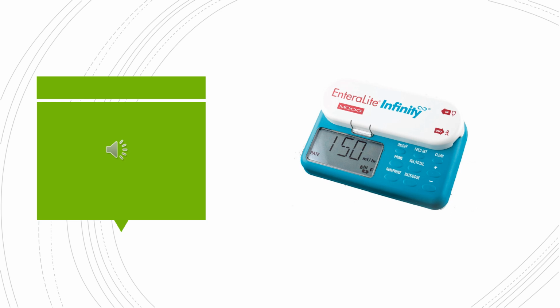Make sure that the pump is on hold whenever you're disconnecting from the feeding tube. And always flush the feeding tube with water after disconnecting from the feeding pump. Never leave tube feeding sitting in the G-tube, as it can form a plug very easily.